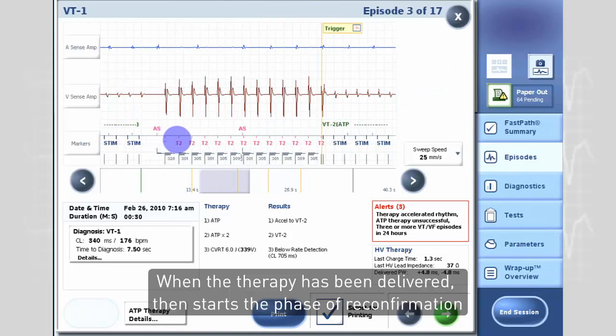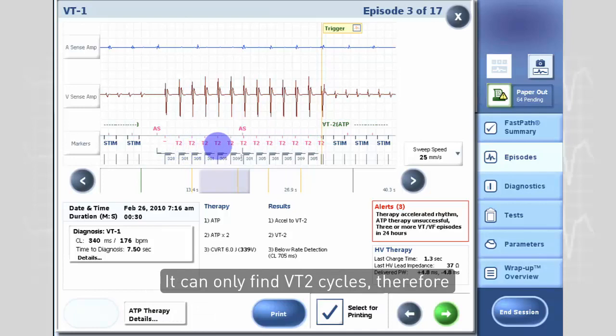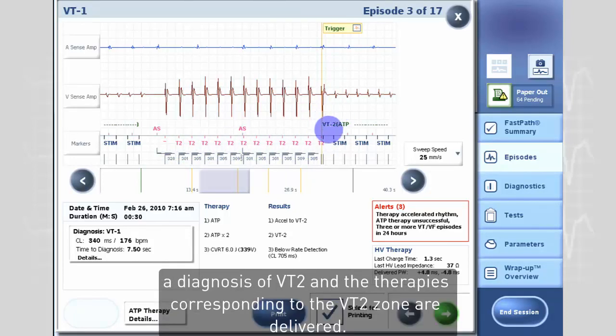When the therapy has been delivered, then starts the phase of reconfirmation. You can see here that once more there is a competition between the VT1 and the VT2 counter. It can only find VT2 cycles, therefore a diagnosis of VT2 and the therapy corresponding to the VT2 zone are delivered.